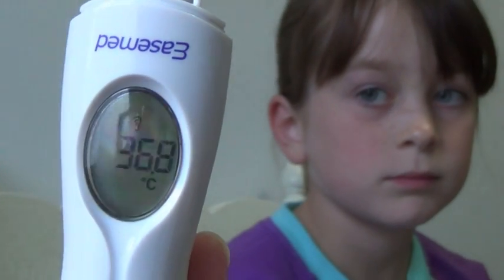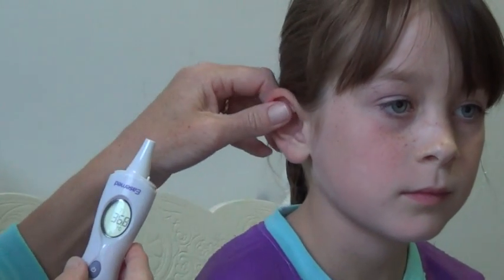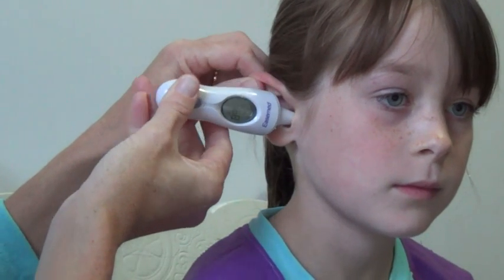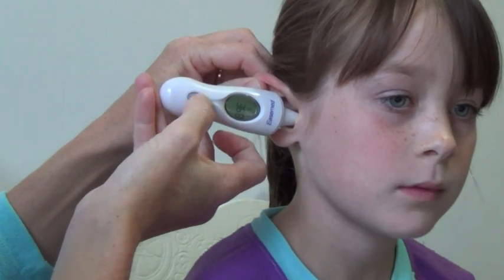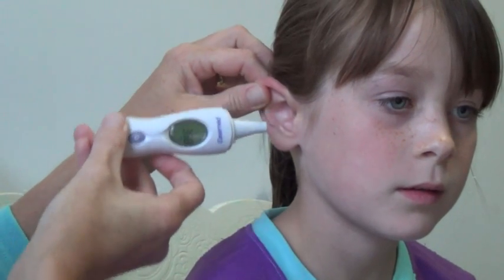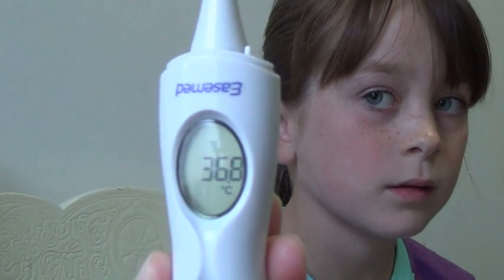The last reading will be there. So you just pop it in the child's ear by pulling the earlobe up and out, pop it in, press it once and then release, hear the beep, take it out and there is your reading.